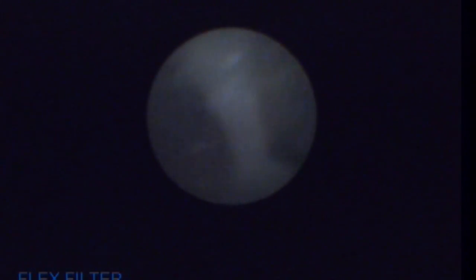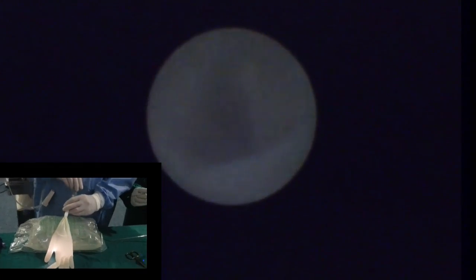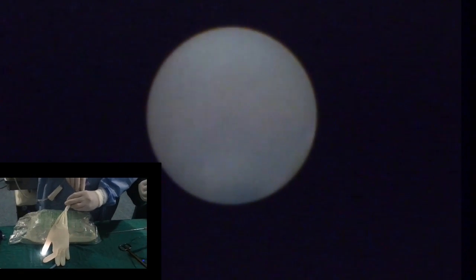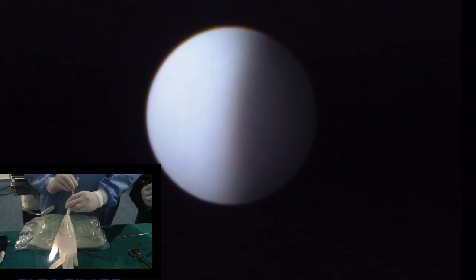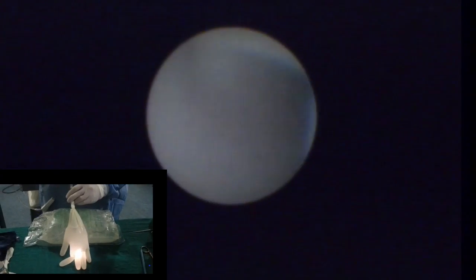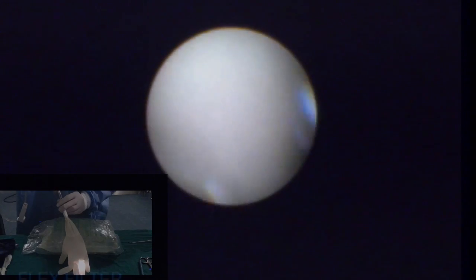Endoscopic exploration of the glove. The finger entries can be assimilated to calyceal entries. Endoscopic exploration of the glove fingers, beginning with the thumb. Endoscopic exploration and localization of the stone.